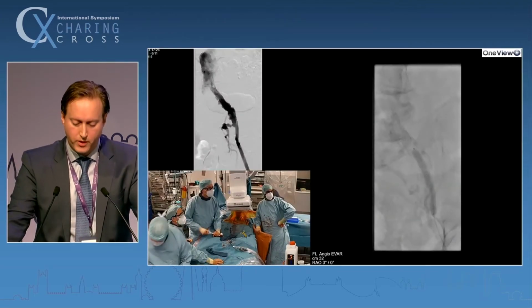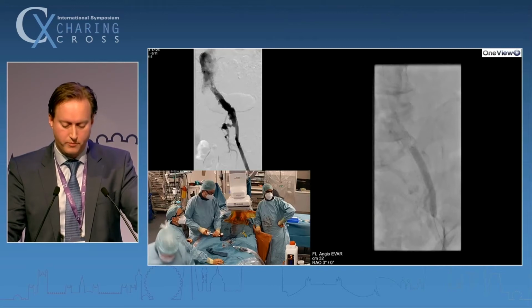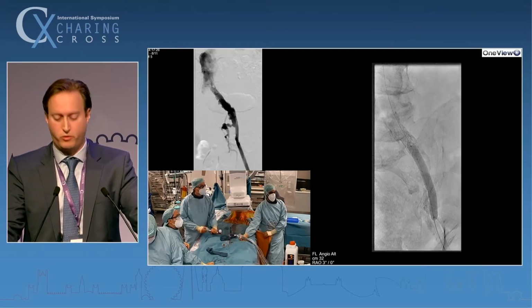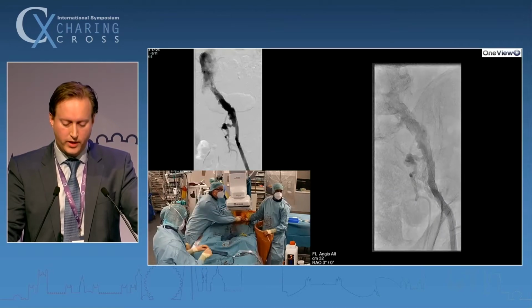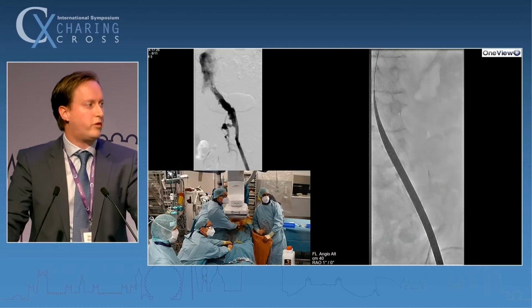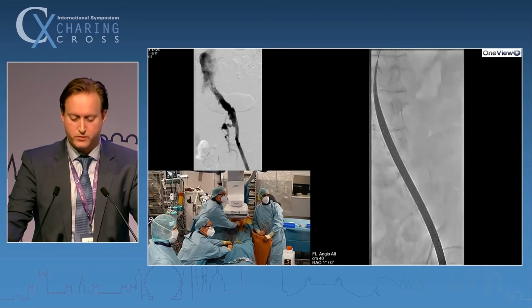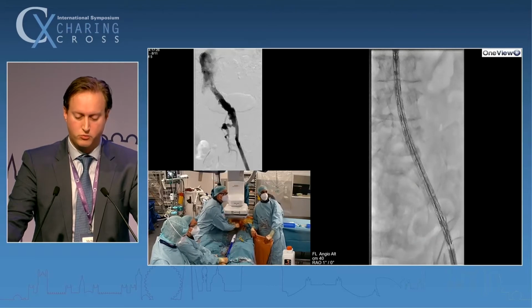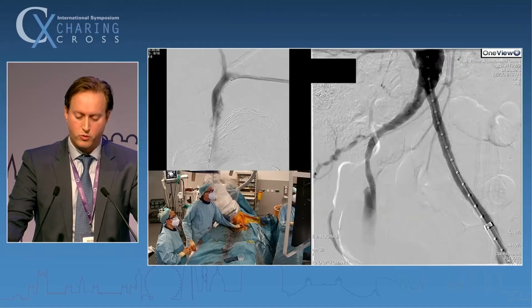Here's a short video where you can see the IVL working, first dilating to 4 atmospheres, and then going up to 6 atmospheres. Of course, after that, there was no problem to advance first a dilator. Before I unpack the more expensive device, I first check with the dilator that I can pass through, and then you can see how smoothly the endograft could go over.